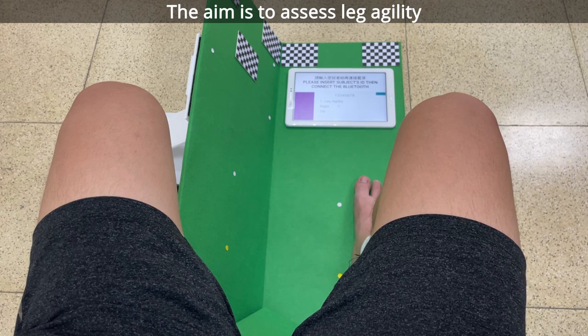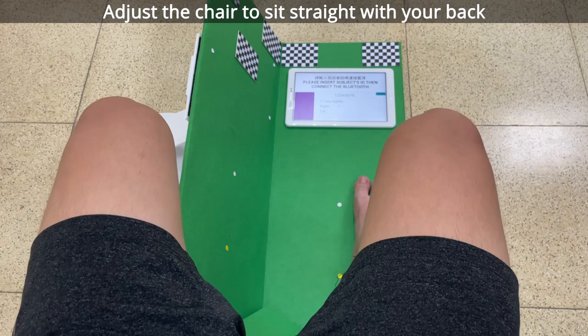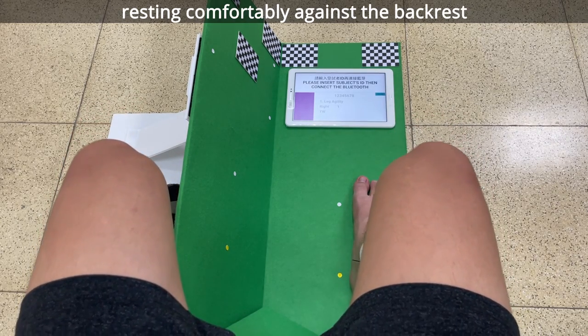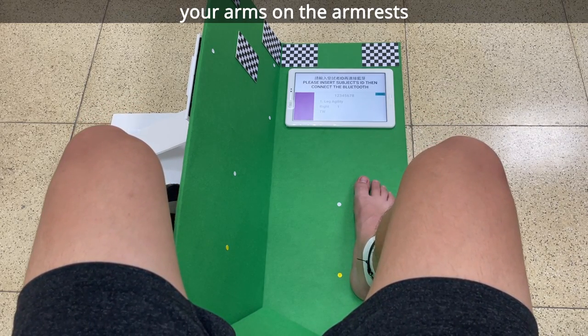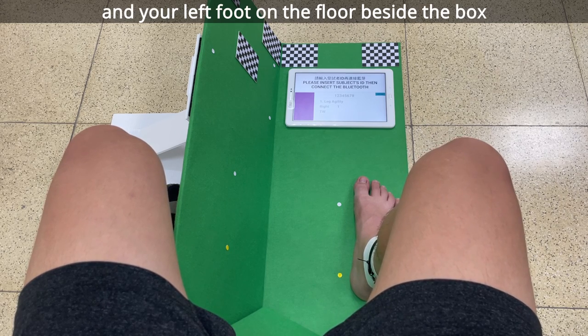The aim is to assess leg agility. Adjust the chair to sit straight with your back resting comfortably against the backrest, your arms on the armrest and your right foot in the box and your left foot on the floor beside the box.